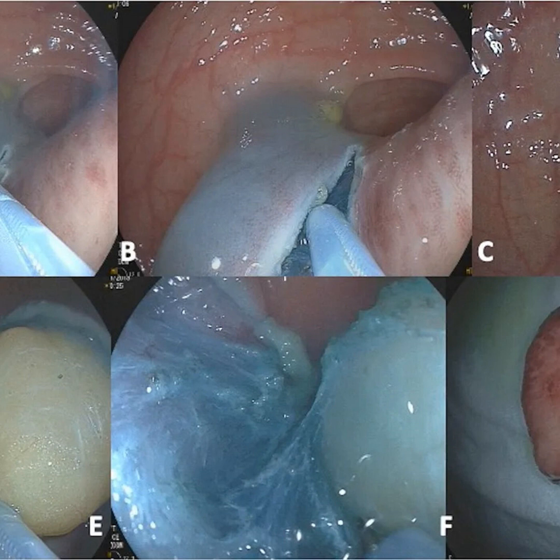EMR resects lesions piecemeal after elevating them off the muscle using submucosal lift. A snare placed around the raised lesion applies electrocautery to remove the tissue above the cushion. Larger growths are divided into sections for serial EMR.